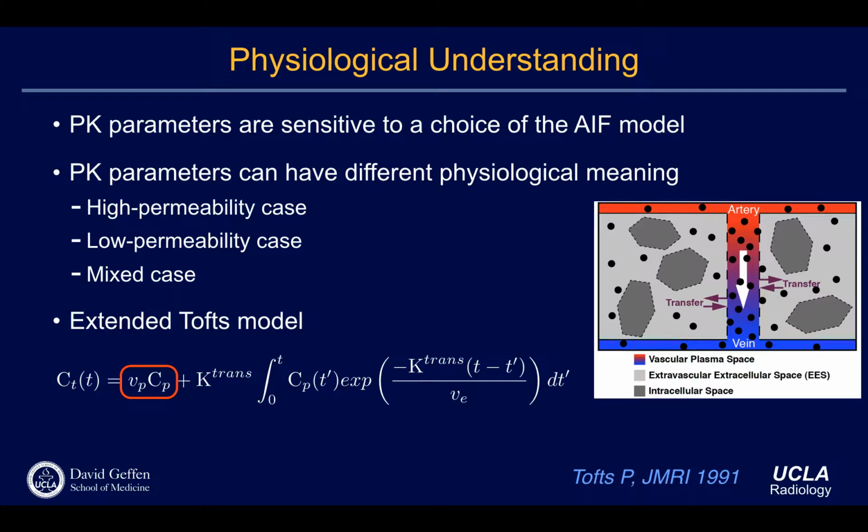So to answer your question, you have to be very careful to understand it, not try to map it one-to-one. Rather, I would say you just use K-trans by itself, and then see that it has an inherent meaning, particularly in the tumor area, that has some meaning of perfusion. You're more interested in the tumor, right? So for tumor, it's more flow-like. Yes. But we're not really differentiating tumor type based purely on the flow information. So it is representing or showing some information about flow in the tumor, but not necessarily showing flow only. K-trans has more information and different aspects of information. Yeah. Well, in this case, you're not doing a flow MRI, this concept. You're not doing any.